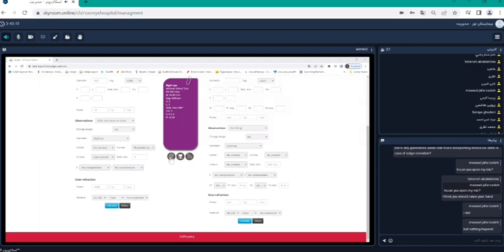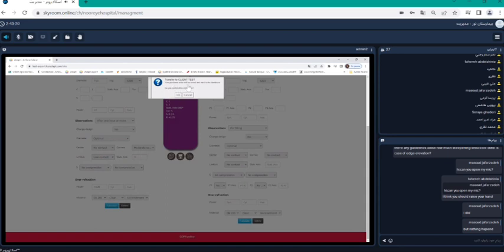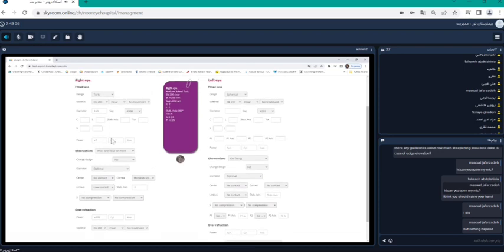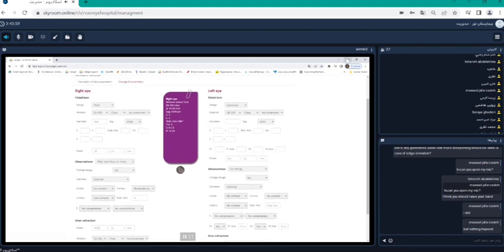And then with this arrow sign, if you press that, there is a message saying, do you confirm this order to, well, here it's client test because this is a demo, but it will say transfer to TGT. Do you confirm? I say yes. And then I will receive an email. You will receive a confirmation order in your own email, and TGT will receive the order directly. So once again, it has been done in order to help you solve the different needs. So I advise you to play with it and to use it, because this is the easiest way.